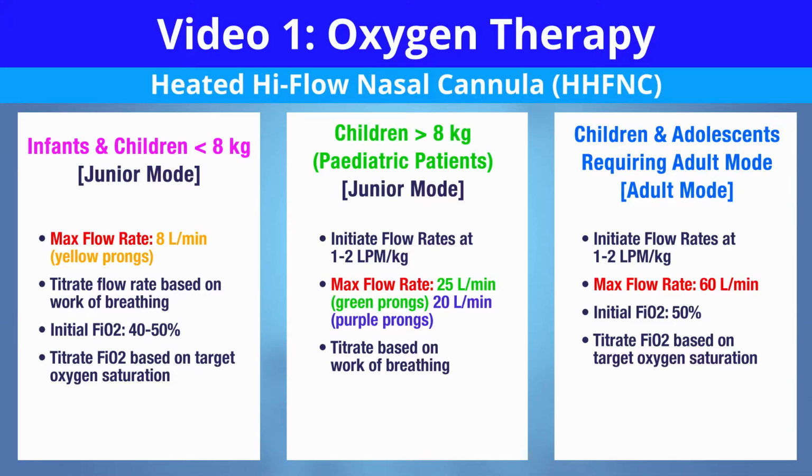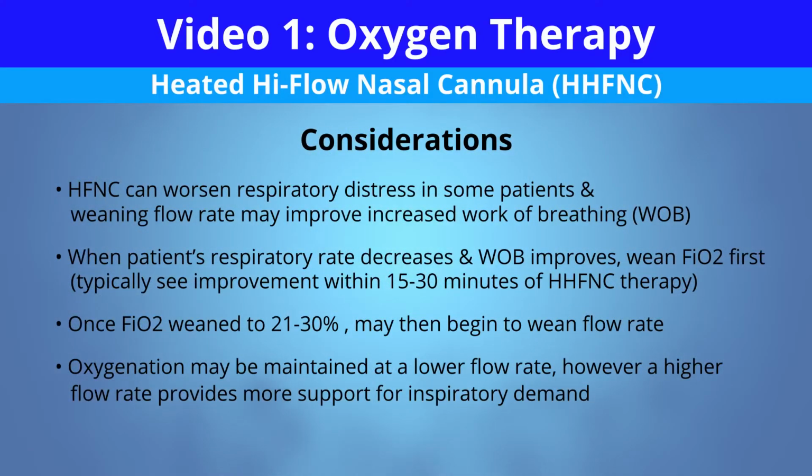Okay, so another thing to keep in mind when starting high flow is there is always the potential that you may worsen a patient's distress or work of breathing if you start the flow too high. So the biggest thing to keep in mind is if you feel that your patient's work of breathing and distress has increased upon initiation of high flow, consider decreasing your flow to see if that will make your patient more comfortable.